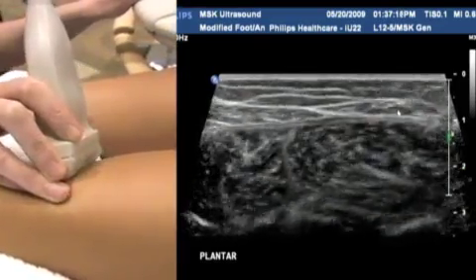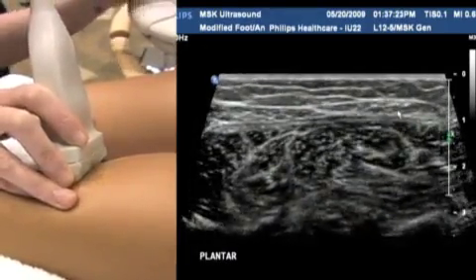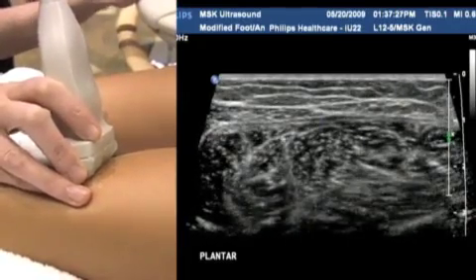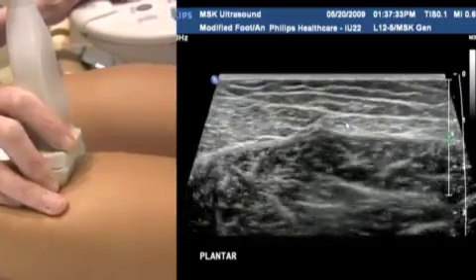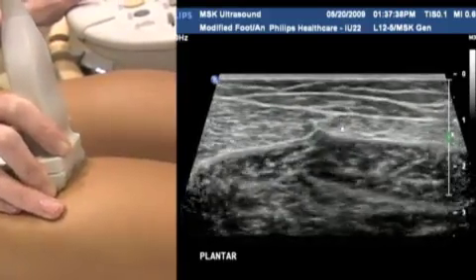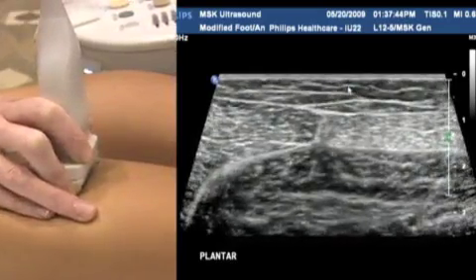Something to be aware of too, sometimes when the Achilles tendon tears, or a muscle in fact, or any tendon tears, it can be associated with a fluid collection. Something to be aware of just sitting underneath the Achilles tendon. Just stay really cognizant of any fluid that might be in the area. So into the gastrocnemius muscles we come now, medially, laterally, soleus underneath, and the Achilles tendon is completely gone now. We know we've covered its entire length because we're up in the muscle bulk.